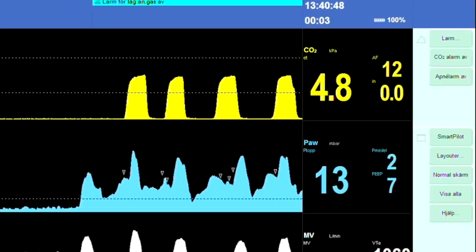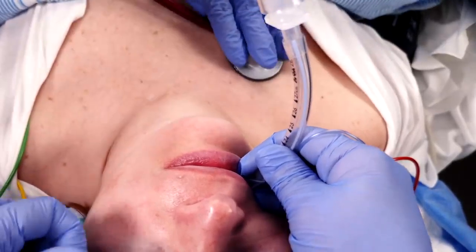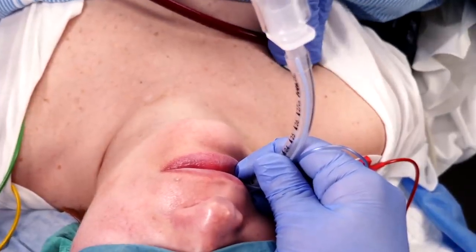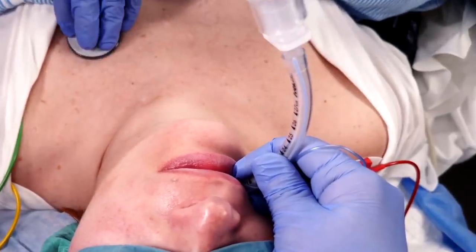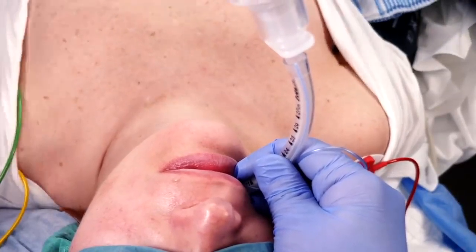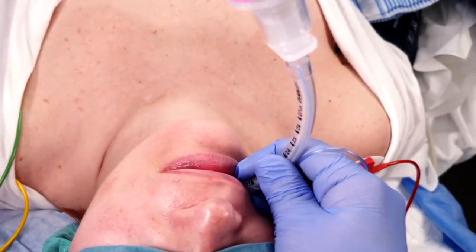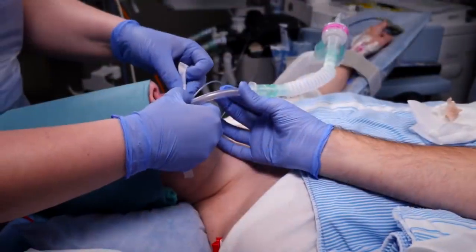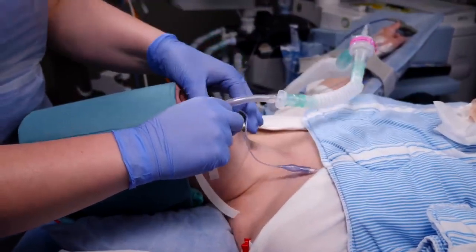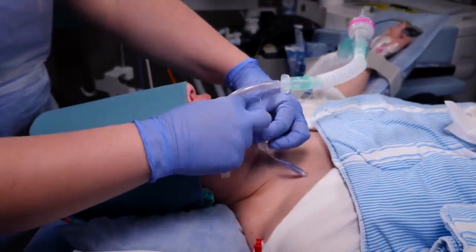Be very cautious when interpreting the other signs traditionally used: auscultation findings on both lungs, condensation in the tube, and the symmetric rise of the chest wall — as these may very well be positive despite an esophageal intubation. When you're absolutely certain that the tube is in the trachea, secure it with tape and initiate mechanical ventilation.